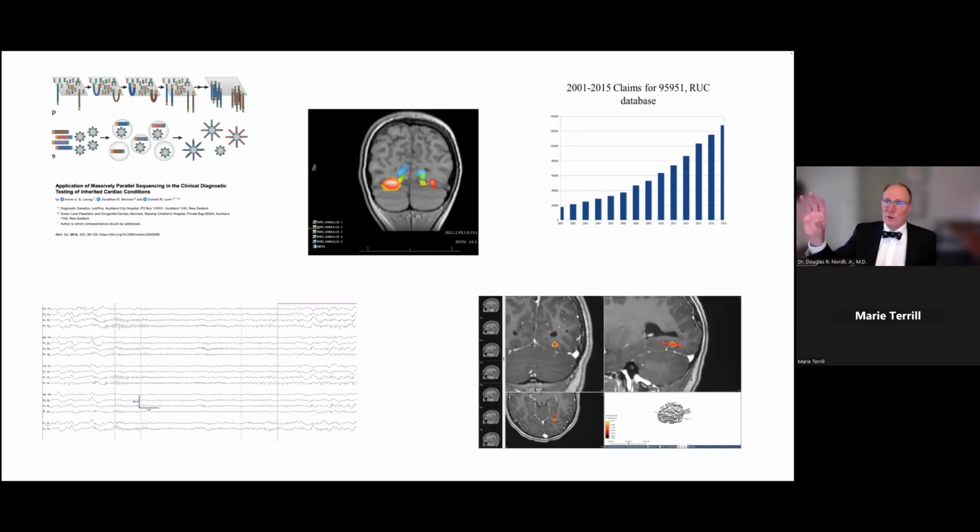You see in the top right portion that our world is just becoming inundated with continuous EEG information. It's growing at such a rapid pace. And then when we're dealing with our patients, we have a large volume of data. Sometimes it's just ictal EEG information shown down here in the lower left.